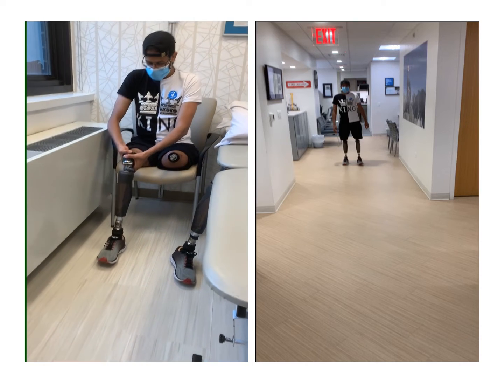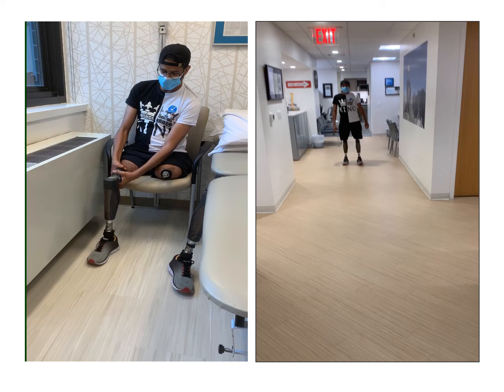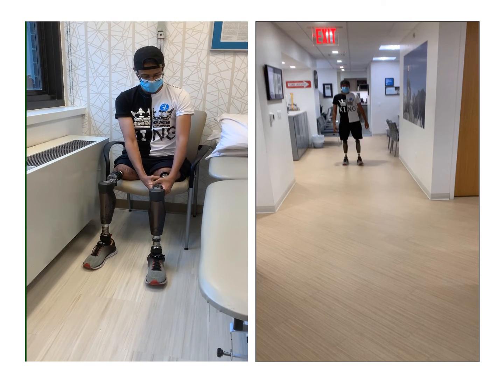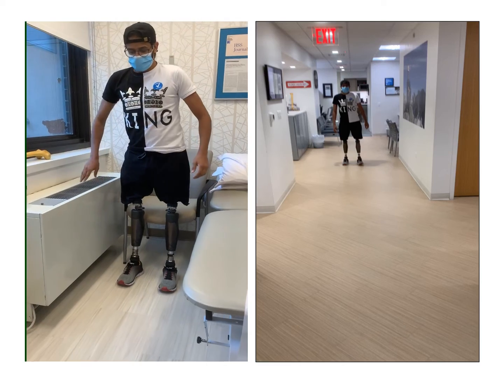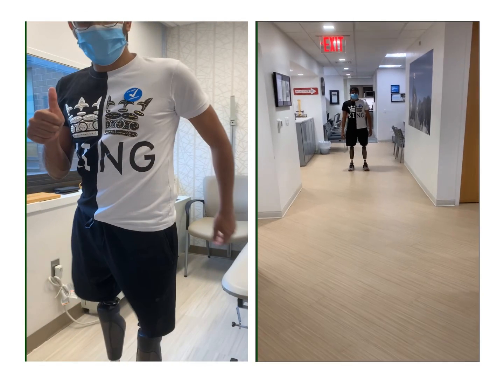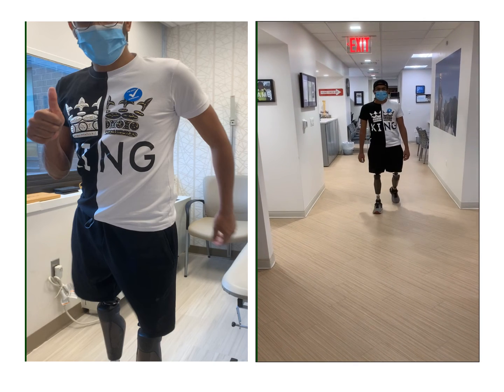Pictured here is Thamer about eight months after the initial surgery, showing the quick connect of both limbs and showing how quickly he's able to do it. And then demonstrating his ability to walk without any assistance.